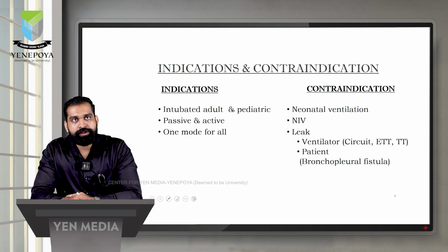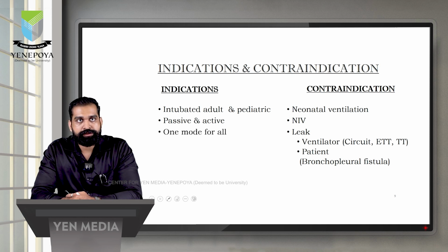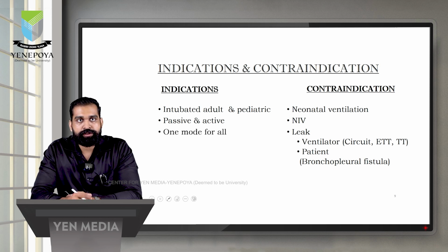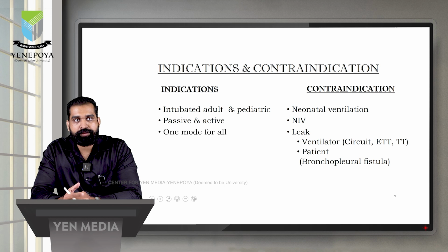Now, coming to indications and contraindications, the indications include adult and pediatric patients of all kinds and all pathologies. You can use it in active patients as well as in passive patients. So in a way, it is called one mode for all. And it is also described as a no mode, as it does not have the specific character of a mode. It is also called an integrated mode because this one mode integrates the function of 3 different modes.